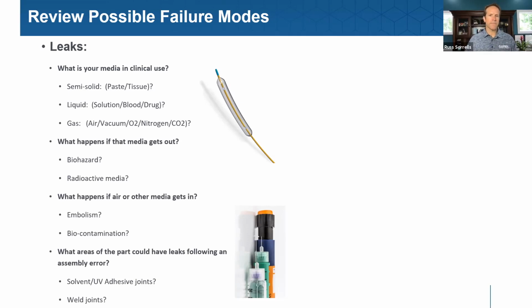Hey Dave, looking at the balloon style catheter type. Maybe that's not exactly what that is, but it looks like a version of that. Yes, sure. That is a very common medical application. I know it presents a myriad of challenges for those types of devices, and the industry primarily dunks them underwater. Has there been any technology that has proven to be reliable in testing those types of devices?